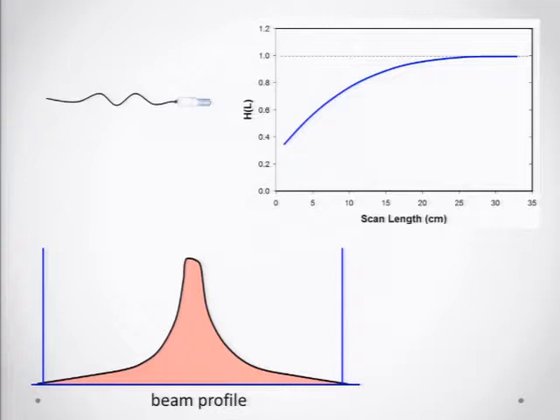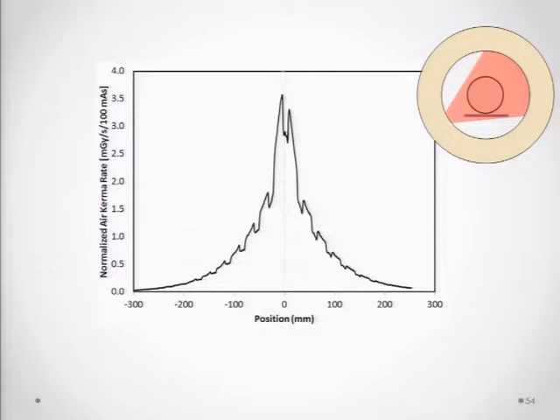Now, I showed you the idealized curve here that I drew. This is a physically measured one, and you can see that it's got some notches in it, and those notches are the reality of the table. And you can see as the beam rotates around, at some point the beam is attenuated by the table, and that's what corresponds to the notch. I'll just point out that when you integrate this, as I showed graphically in the last slide, those notches essentially go away. So it's really not an issue for a real clinical environment there.